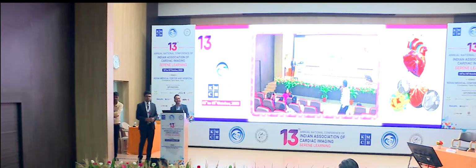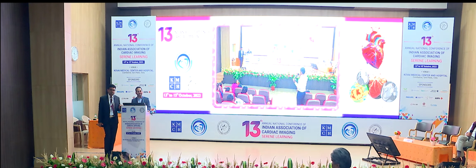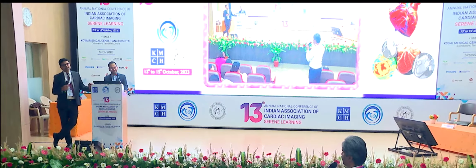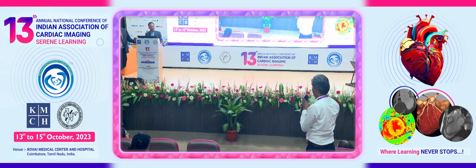When we talk about the calcium score, we are looking only at the Agatston score, the number. What about the other information we get from the calcium scoring program, like the density factor and the volume? Do they have independent risk value, which generally we don't give too much significance? I think there is literature saying the density factor especially may be important, but I don't know how much people are applying it clinically.